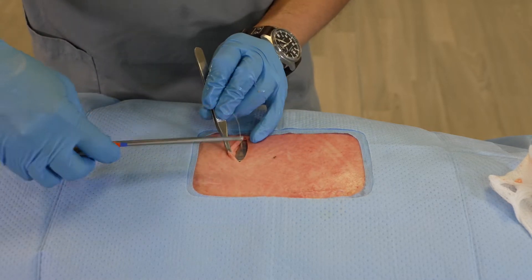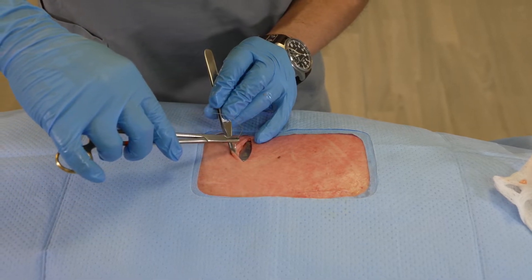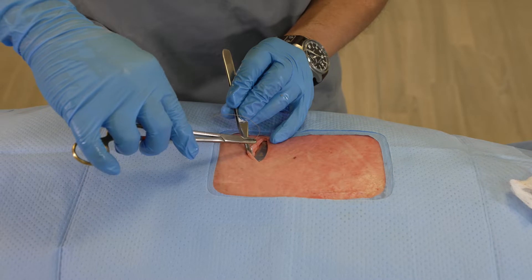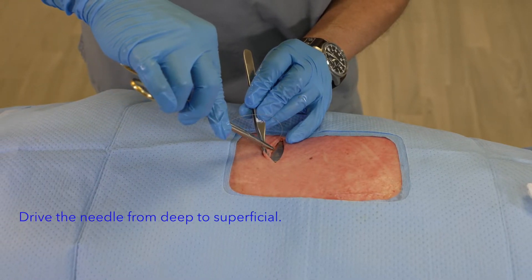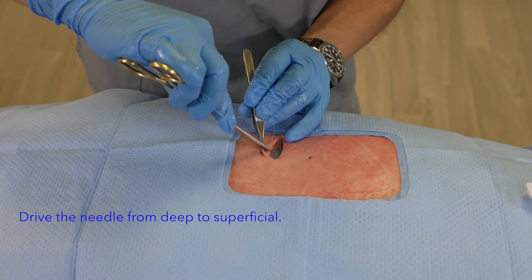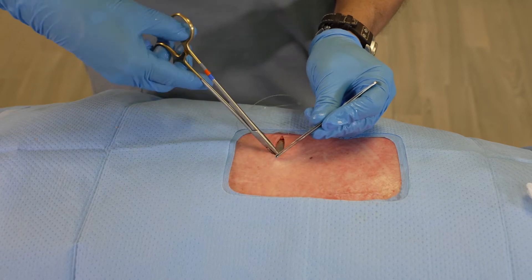In this case, we're going to do our deeper layer first. In order to do so, we're going to advance this towards the apex of the incision and we're going to come out of the apex in this manner.